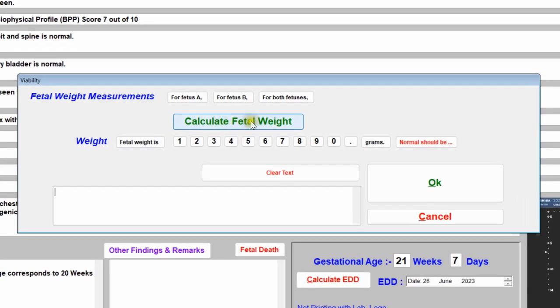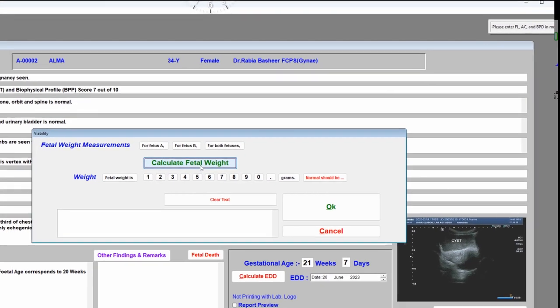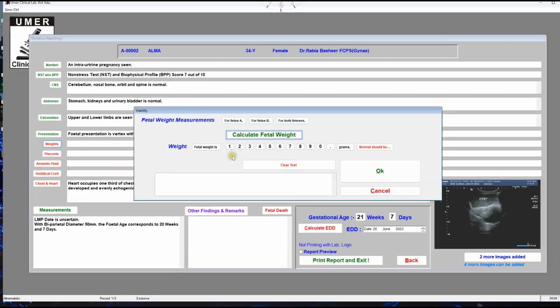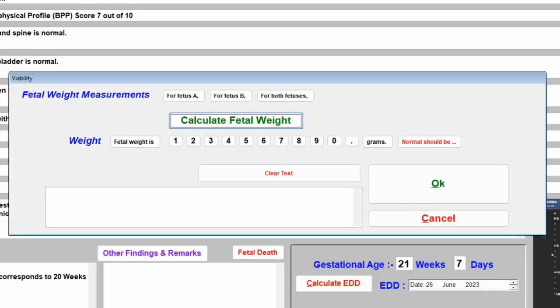To calculate fetal weight, click the calculate button and it will calculate automatically. However, for this calculation you must have entered BPD, abdominal circumference, and femur length in the measurements. If these are missing, it will prompt you: 'Please enter femur length, abdominal circumference, and BPD in millimeters.' Once those are entered, the software uses a built-in formula to calculate fetal weight automatically.